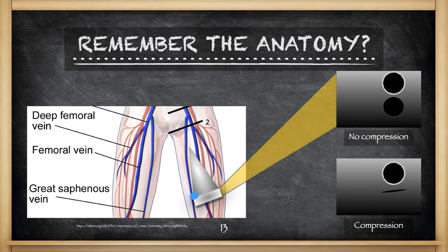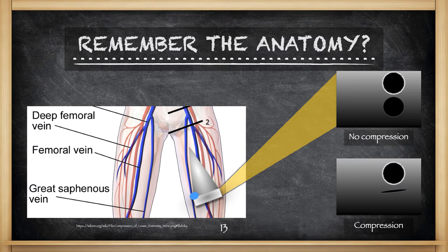As you migrate down the leg, you're probably also going to have to orient your probe more medially. When you do that, you're going to need to rock the probe so that the probe face creates a sandwich between the skin and the femur, with the blood vessels in the center. This allows you to have two firm structures on either side of the blood vessel for compression. If you're unable to use the patient's femur as a compression point, you can always use your non-probe hand on the back of the patient's thigh to provide gentle upward pressure, which will displace the tissue and give you a firmer structure to compress against.